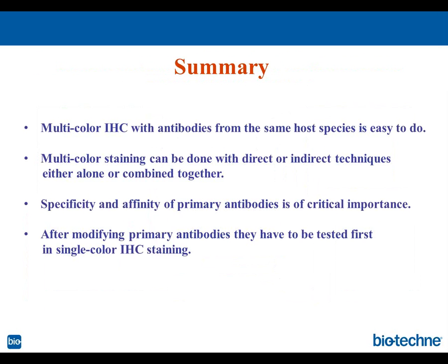Okay, that's great. Thank you. Somebody's asked here, can we get more details about the resources and methods used to conjugate the antibodies? That's a good question. We do not make any conjugation kits here at this point, and you may try to find conjugation chemicals from other companies. Thermo Fisher, I'm sure, has a lot of them, and other chemical companies. So they are available off the shelf and can be found easily if you just Google it.